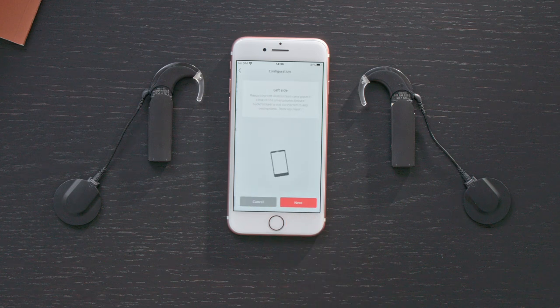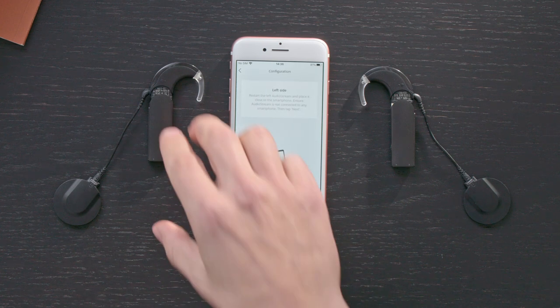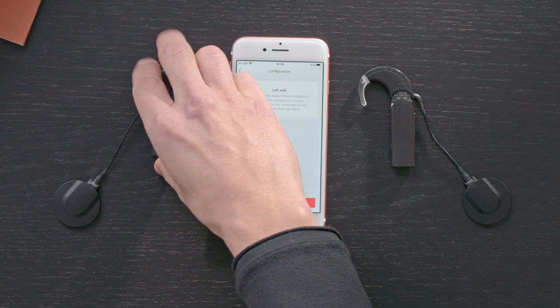Tap Next. Then slide the AudioStream cover completely over your audio processor. Place it next to your phone and press Next.